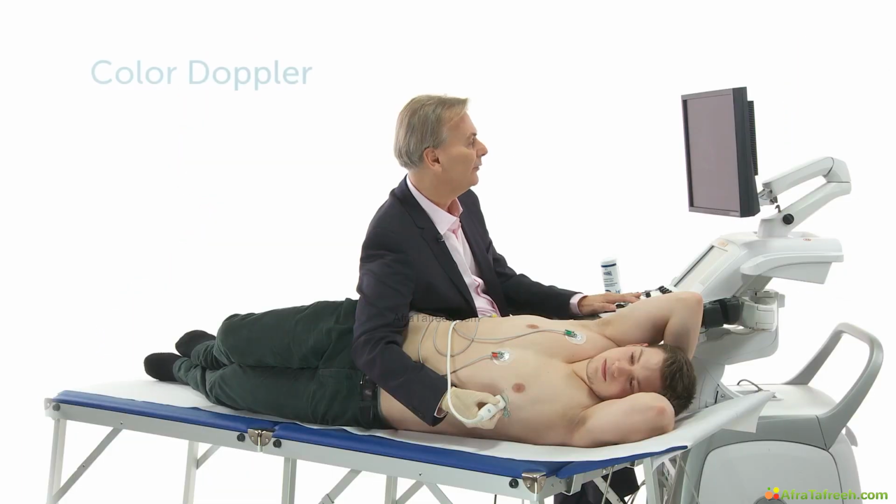And many different diseases can lead to regurgitation. But before we really detect mitral regurgitation, we have to understand how color Doppler works. And this is going to be the next part that we're going to look at in our patient demo. First, we turn the color Doppler on. And then we get the color Doppler information in the region of interest, the color box.